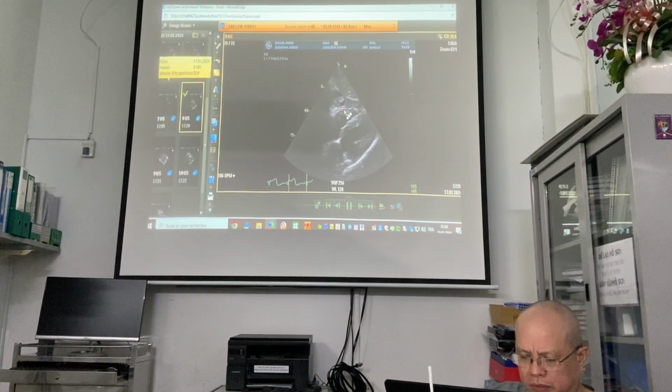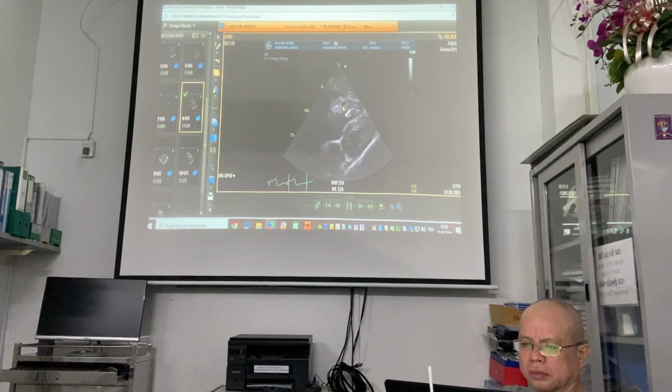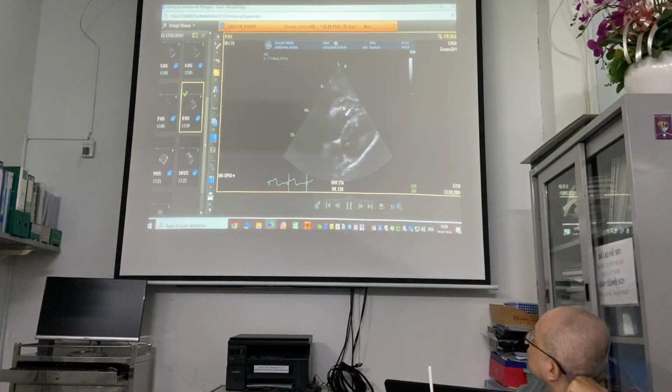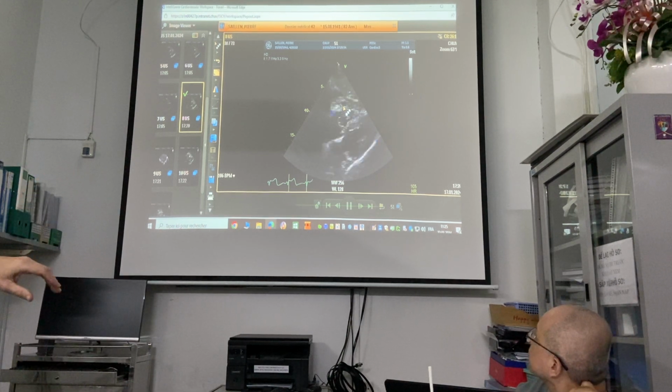What do you see here? This is a few days later. This is 1 day later. You see this here? So basically what happens, so why did this happen, you think? This complication. There is some cavity, there is a blood cavity in the wall, you see?